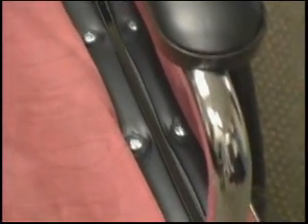When using a seat cushion with the Jerry-Lock brake system, it is important to note that the cushion may interfere with the brake system's operation if it is wider than the seat. The screws that secure the seat material to the frame on both sides of the wheelchair should remain visible when the cushion is in place.